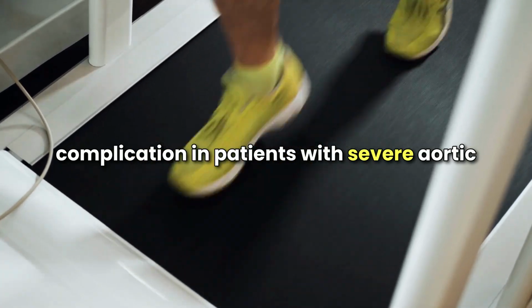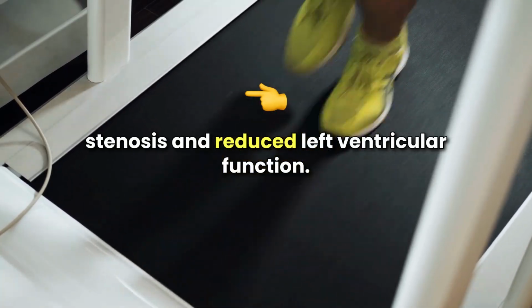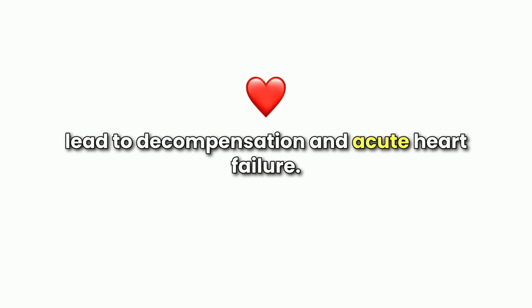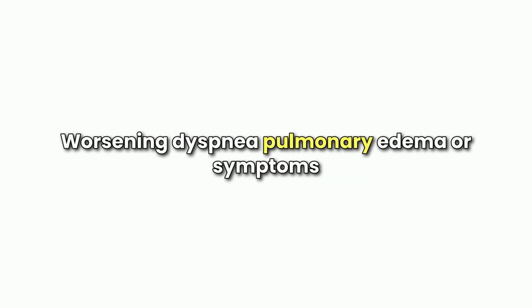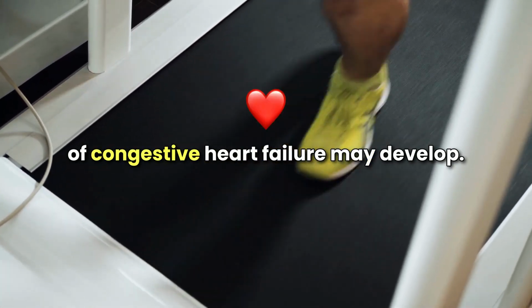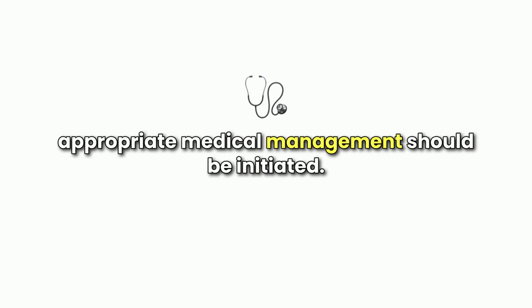Acute heart failure is a serious complication. In patients with severe aortic stenosis and reduced left ventricular function, the increased workload induced by dobutamine can lead to decompensation and acute heart failure. Worsening dyspnea, pulmonary edema, or symptoms of congestive heart failure may develop. The test should be immediately stopped if heart failure symptoms occur, and appropriate medical management should be initiated.